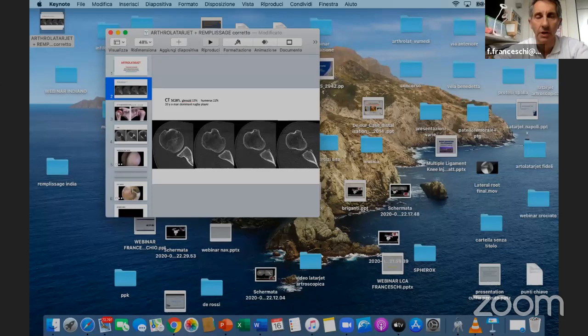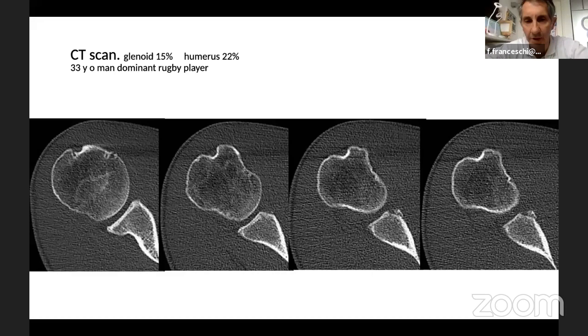Please go. Sorry. Okay. I don't want to repeat the concepts that Ettore explained really very well, so I skip the presentation. I start only with a case that maybe shows again the procedure of arthroscopic Latarjet. We talk about the bipolar defect, and we have a lot of procedures that can help us to deal with this kind of problem. But I think that arthroscopic Latarjet can help us when we are not able to predict the condition of the capsule where we are inside the joint.